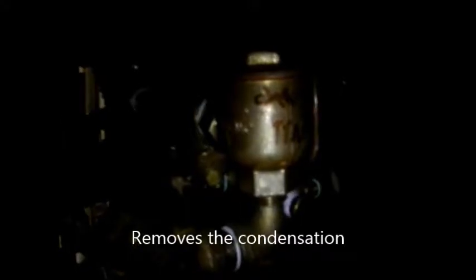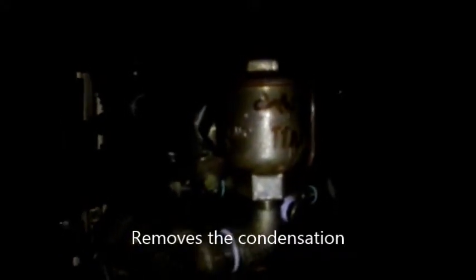Handle is the water shutoff valve. There's the steam strainer. The steam strainer catches all the debris and rust, which has a mesh inside. The steam trap, which catches the air and condensation in the lines.